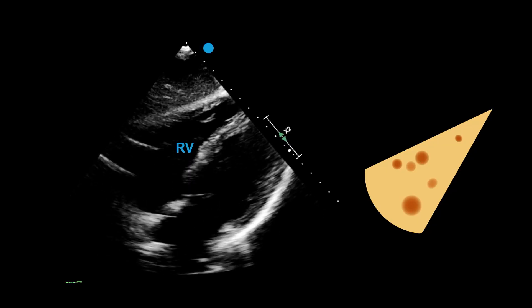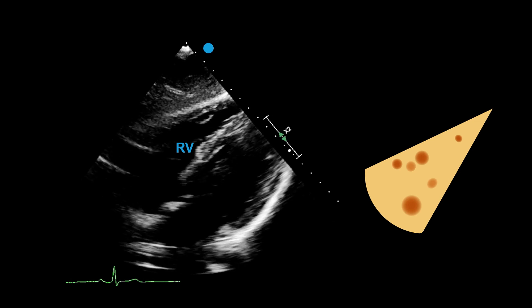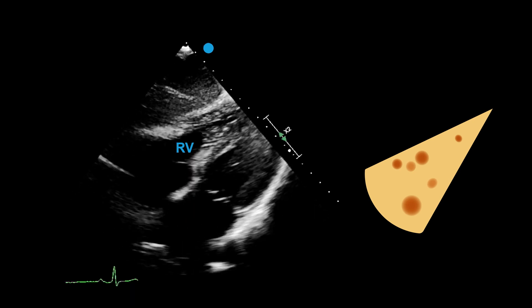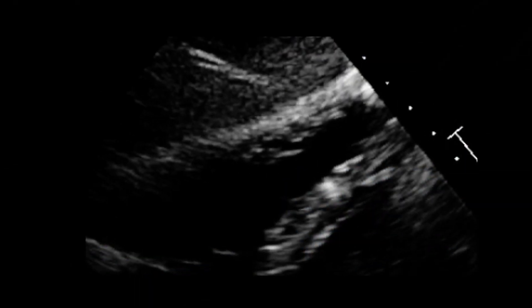The subcostal view is excellent for measuring the thickness of the ventricular muscle. In order to obtain this measurement, zoom in and measure the thickness of the right ventricular wall. This measurement is helpful to understand if the right ventricle is hypertrophied, meaning the muscle is overgrown, and this often happens in response to high pressures in the lungs and the right ventricle itself.